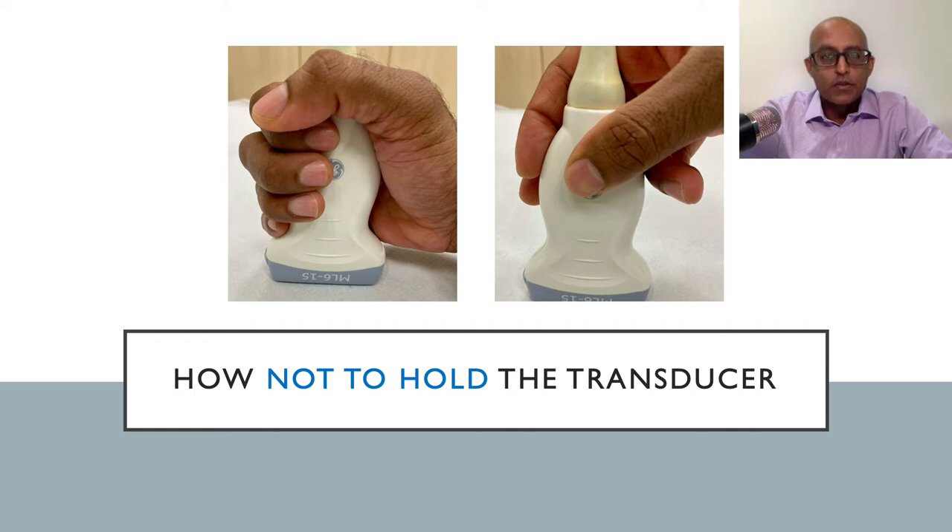Before we consider how to hold the transducer, let's consider how not to hold the transducer. In the images here, there are two grips that are being used. This is commonly seen by trainees or individuals who are early in their ultrasound journey. And while you are holding the transducer quite firmly, the issue here is that you're lacking stability. Because ultrasound is a dynamic form of imaging, you do need that stability to optimise your images, and unfortunately both of these grips do not really confer that.